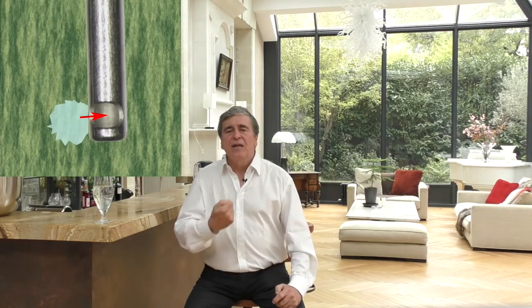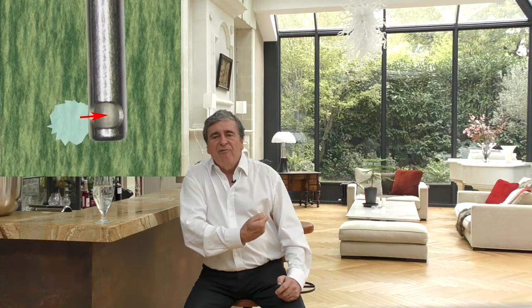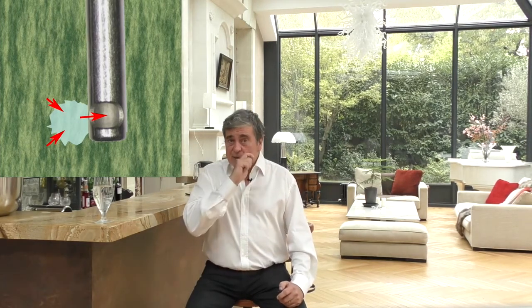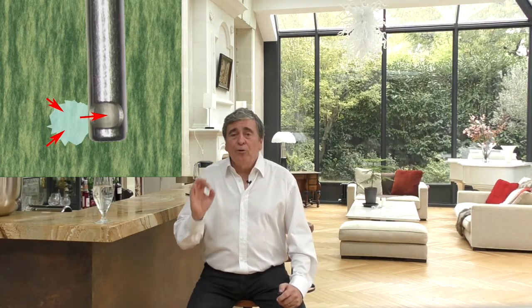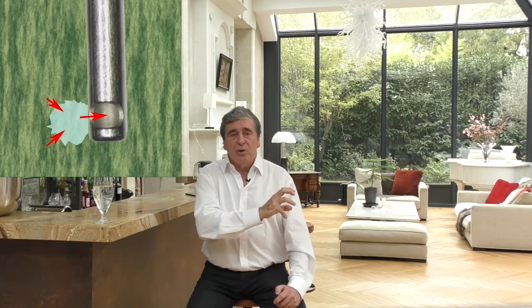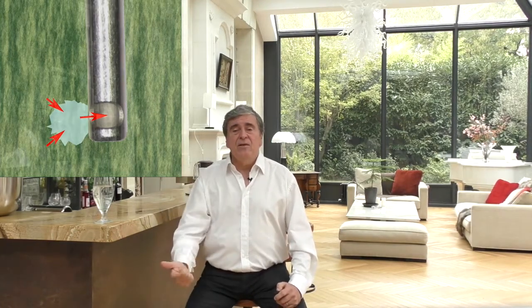If the handpiece does not move, the next time the port is open, it is the flow of BSS attracted by the depression that will drag the neighboring fibers into the port. For this to have time to happen, the port must be open for a time that allows the depression to attract the BSS and then the vitreous. What practical consequences does this have on the cutting frequency?